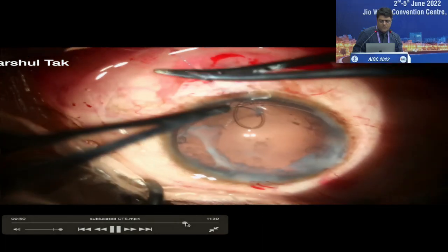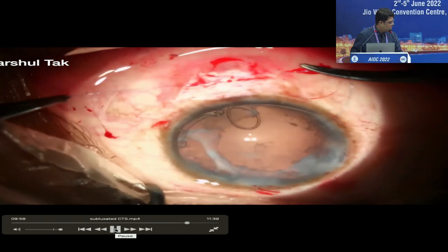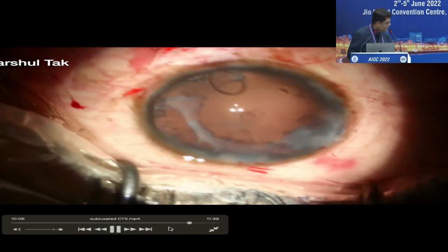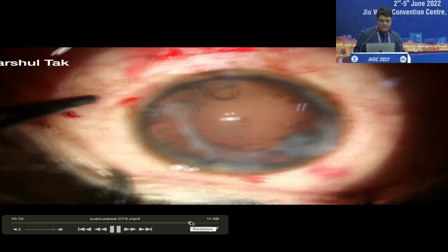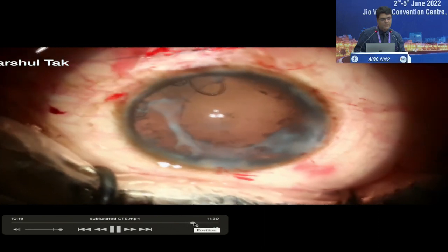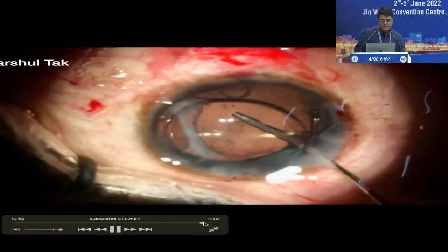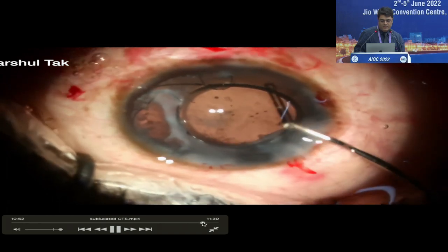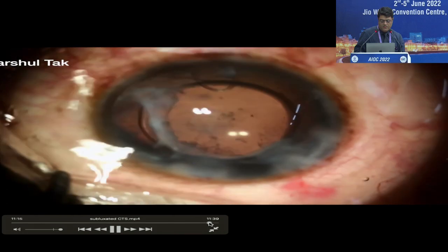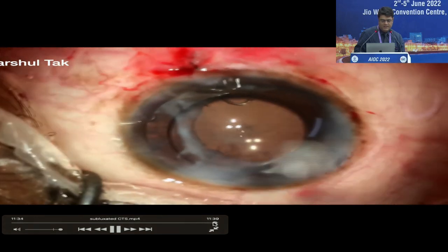Once you railroad these two, some kind of cohesive viscoat at that point on the anterior capsule would also help, to create a space for the needle to come out. Yes, it does. Harshul, have you made a groove there? Yes, that's a groove which I made. The knots always need to be buried. Once I tie the knots, I see that the capsular bag is well centered and perfectly stabilized. You need equatorial support as well as anteroposterior support for long term centration. After that, I go ahead and put a single piece IOL, take off all the OVD and hydrate all the incisions, and that finishes the case.